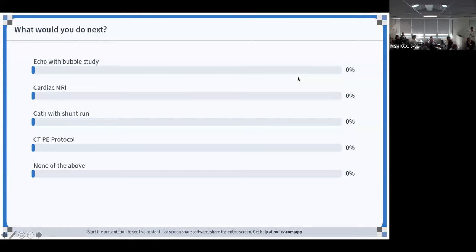As a pediatric cardiologist, when we're looking at those studies and we see RV dilation, and we often do get some of Dr. Zady's patients, we're thinking two things. Is it dilation from RV volume overload, or is it dilation from a cardiomyopathy? Obviously, with ARVC, you can still meet criteria by having normal function, but if you have dilation and RV wall motion abnormalities. So one thing we make sure is, one, we see the RV free wall, and it's very hard because it's very anterior. Another thing we think about too is pulmonary hypertension.